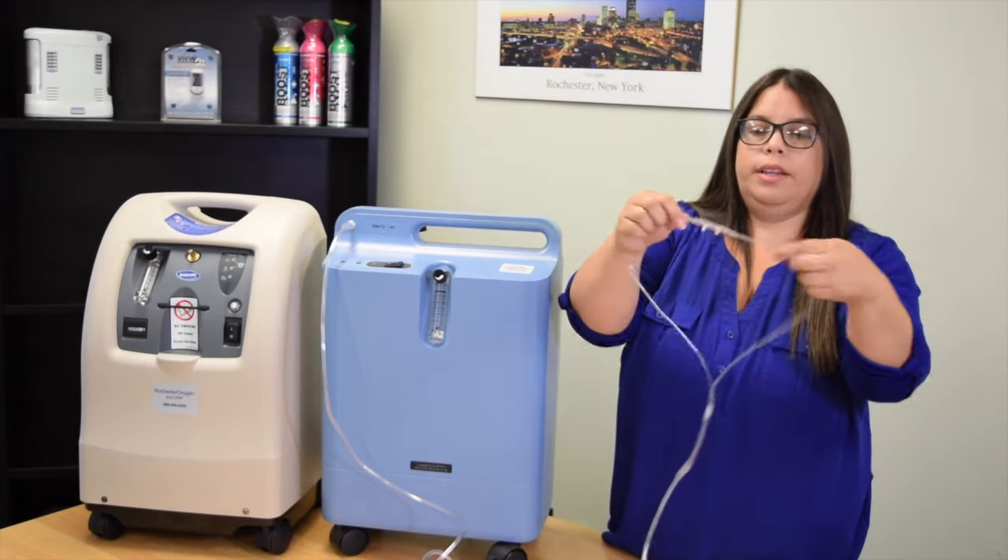Here we have our cannula. To put on your cannula, you will face the prongs towards your nose pointing down. Insert them into your nose, loop the tubing around your ears, and push up the little plastic piece to adjust it around your neck.